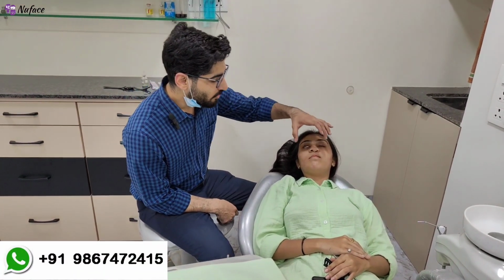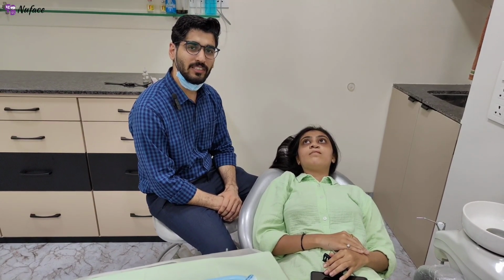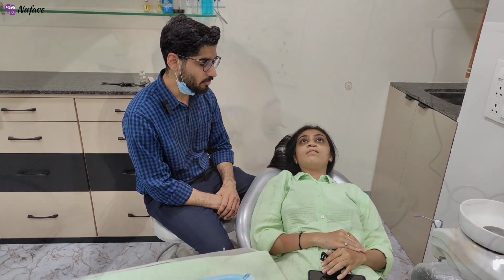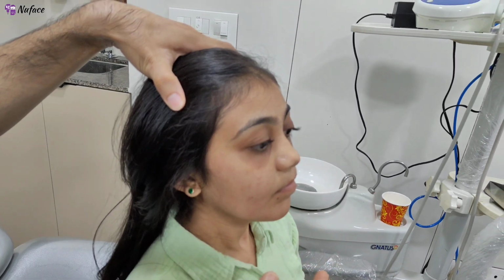But now we have not completed the AMD in its entirety. We had planned for an anterior maxillary distraction surgery, and we started the activation of the distractor device 7 days ago, that is a week ago. And now after post activation day 7, you can see there is a nice fullness of the face for the patient. You can see there is a good fullness of the mid face.